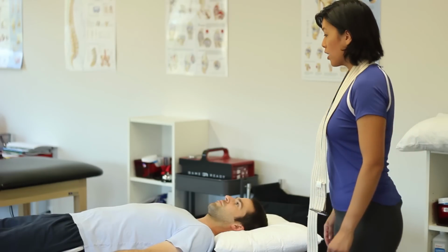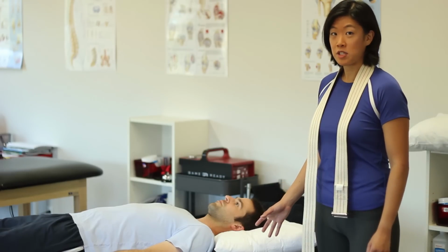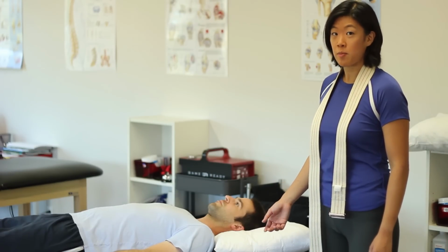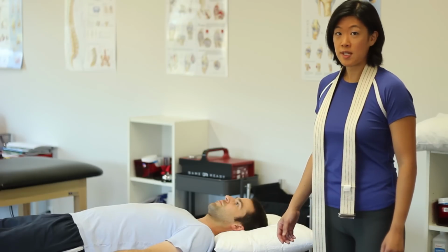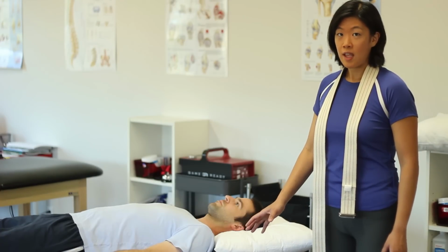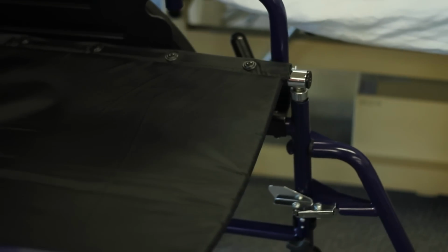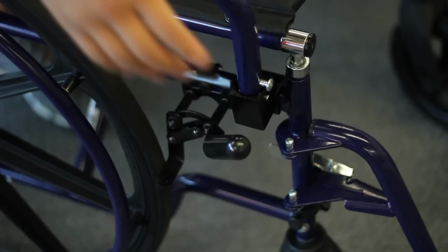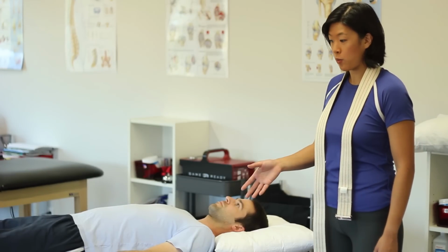First of all, you would want to make sure that there's a sheet underneath the patient so that you can move them and shift them over very easily. Second of all, you need to also set up your environment correctly. Take away all distractions and all obstacles. You want to brake the wheelchair, and you also want to have the wheelchair at a level where the patient would not block or hit the wheelchair.